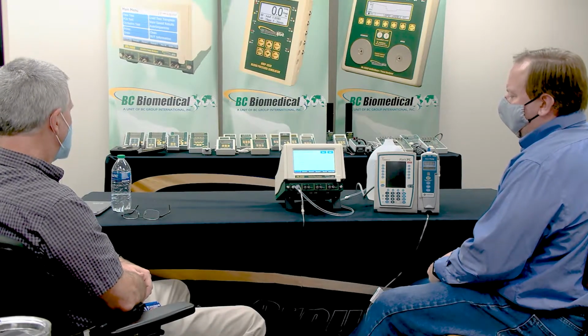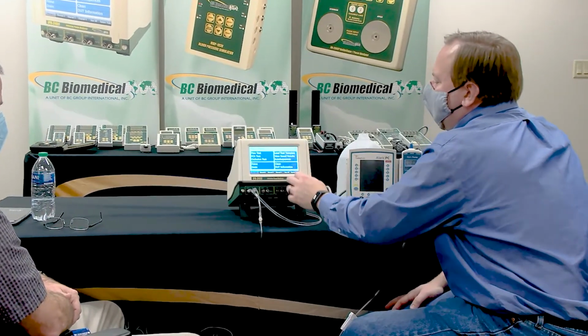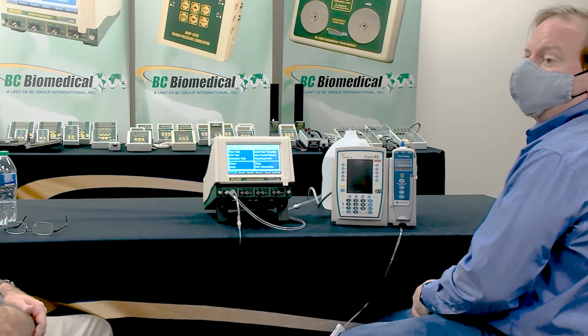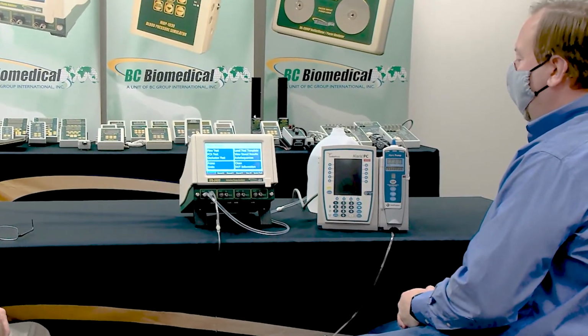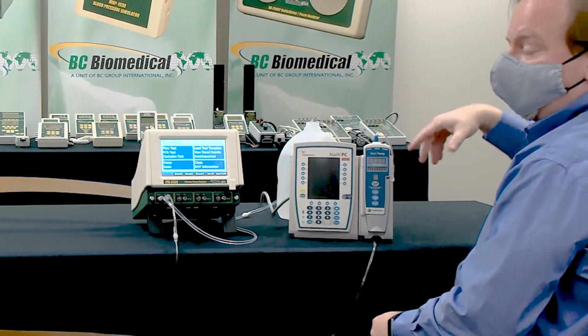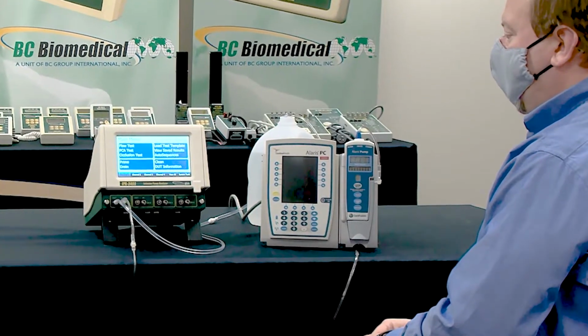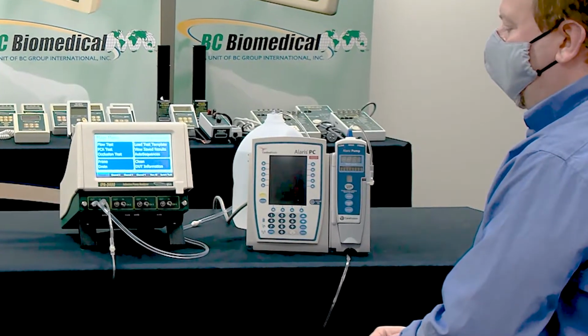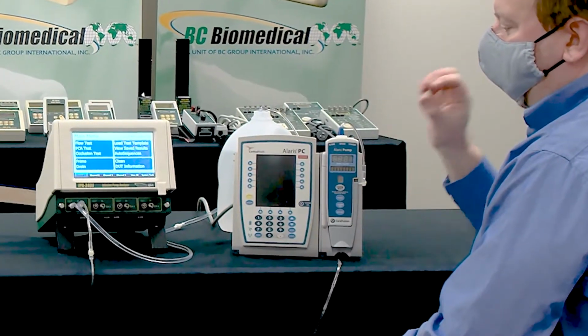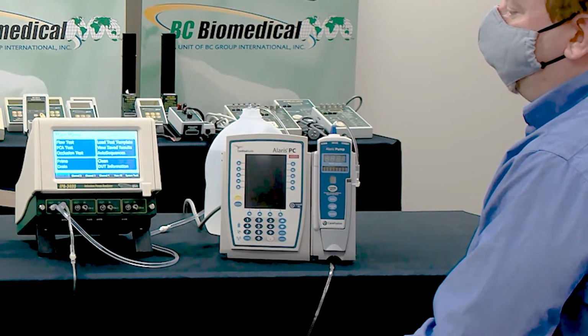Anyway, DUT info, you can do that. That's nice that you can just barcode scan. And so they can print out their own barcodes, put it on there, and do whatever they want, or they could use the OEM barcodes, that sort of thing. They can even do 2D. If you get a 2D barcode scanner, you can pack a lot more data into that 2-dimensional barcode.